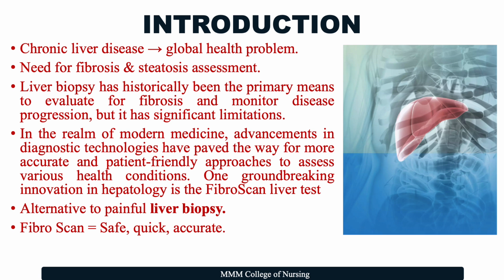One groundbreaking innovation in hepatology is the Fibroscan liver test. It is an alternative to painful liver biopsy. Fibroscan is said to be safe, quick, and accurate.